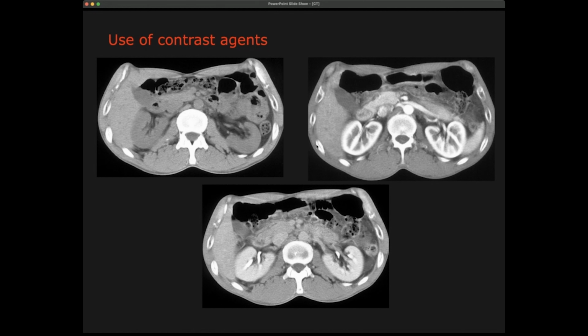Here we know that these are cross-sections of ribs, so this is bone, but this is contrast. What you now also see is that the kidneys, especially the outer part of the kidney tissue, also became bright. It's because the kidney is hypervascularized, and the kidney is the organ that will have to take out the contrast later on.